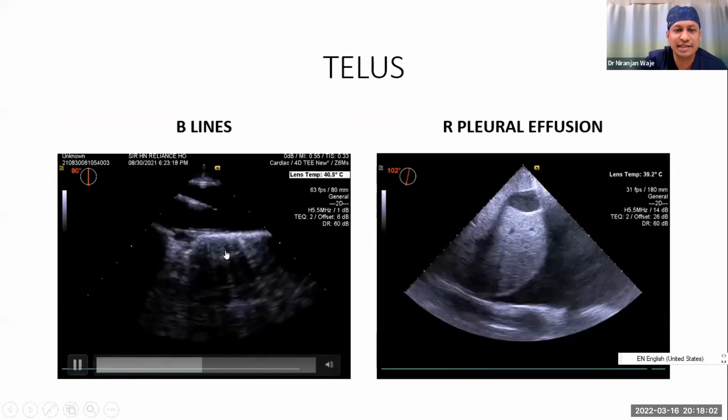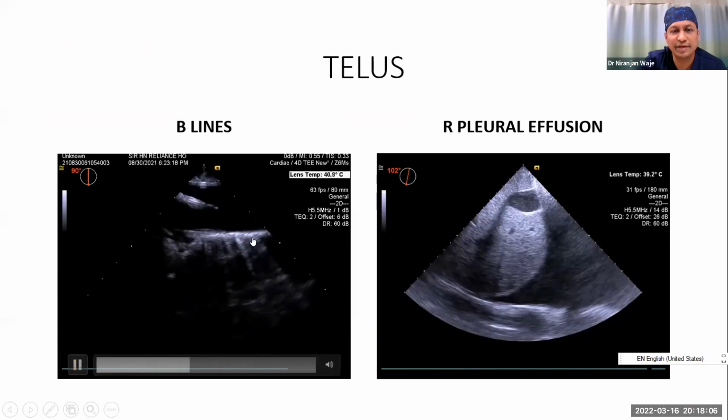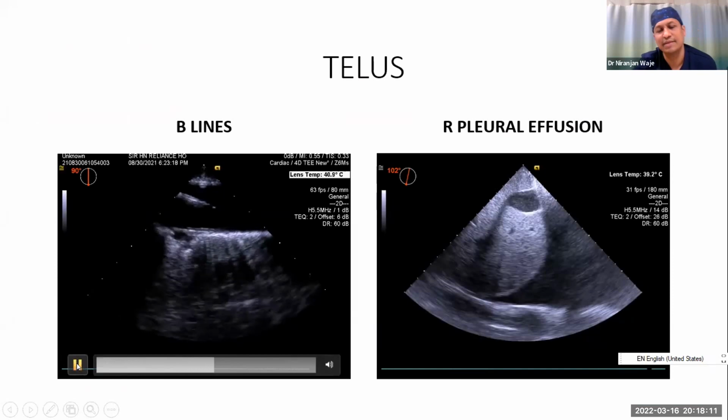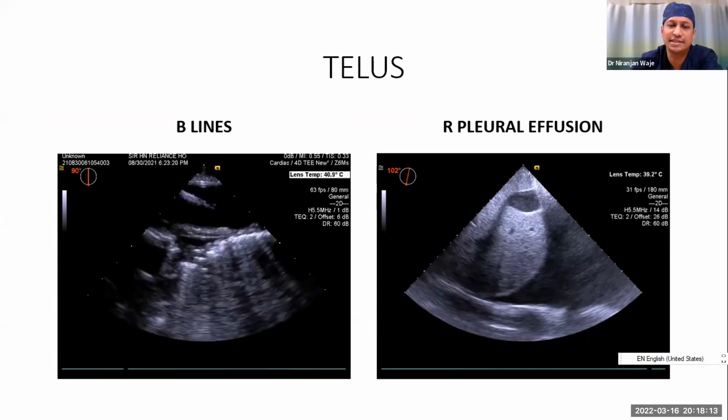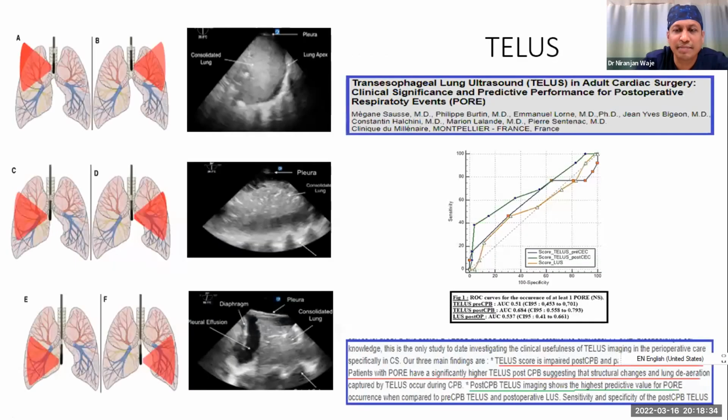If you see this, you can see the lung sliding here on this video. This is the lung sliding. That means it's normal, and you can see multiple vertical lines. So this is a cardiac surgical patient. It indicates that we are on the higher side of the Frank-Starling curve, and we might need to give a little PEEP or administer a little diuretics. We would, however, have to further confirm with indices of diastolic dysfunction. So that way we come to know whether to give fluids, whether to ventilate, and with the PEEP, that has had a positive impact.